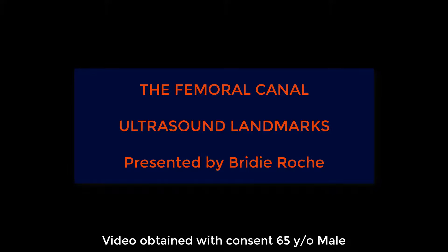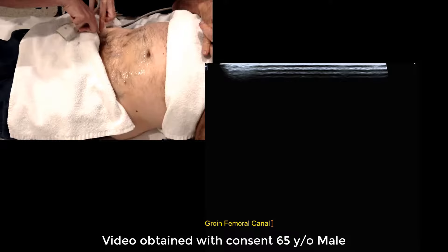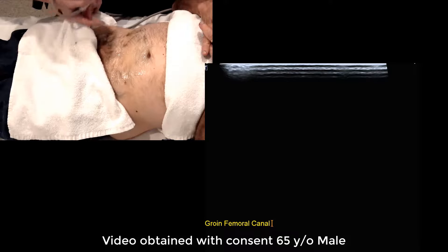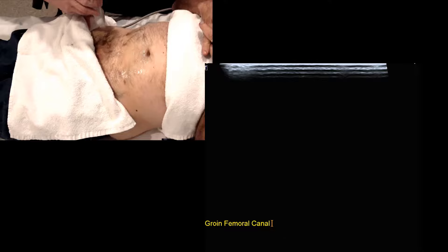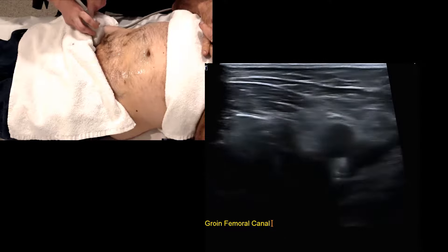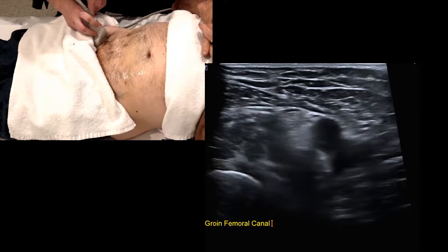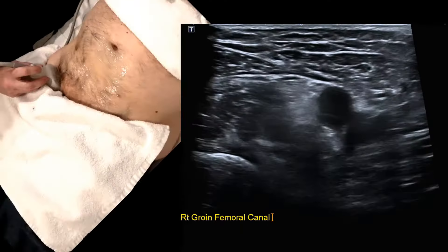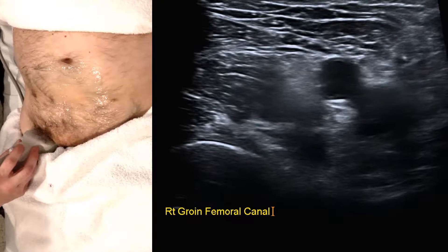We're going to look at some basic tips and tricks for getting around the femoral canal and the inguinal canal. We'll commence with the femoral canal and its various landmarks.